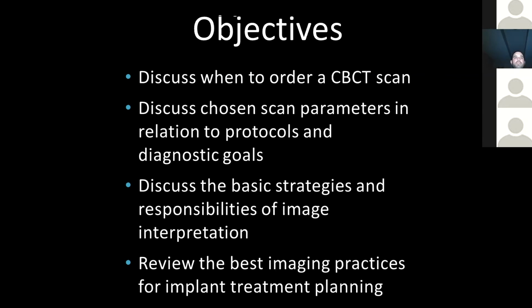So that might be a disc issue. The most obvious one I can think of as a radiologist, and again, I will say that I am not a TMD and orofacial pain specialist. I work with them closely, but I try and support them from an imaging perspective only, is if you are suspicious of a rare joint neoplasm or significant loss of vertical height due to advanced degeneration, that can be a strong indication for imaging.